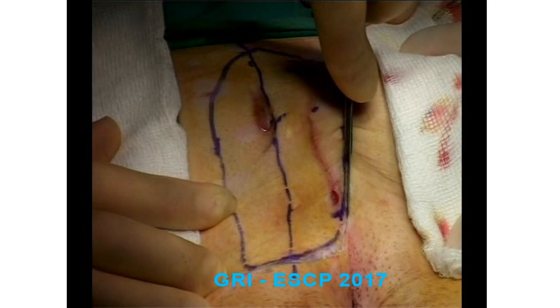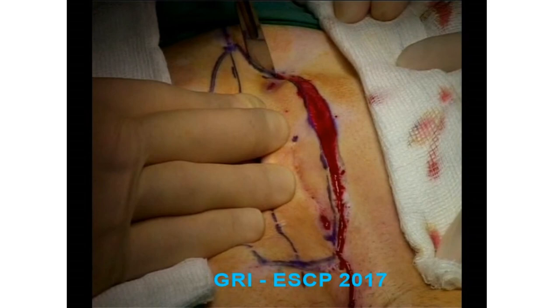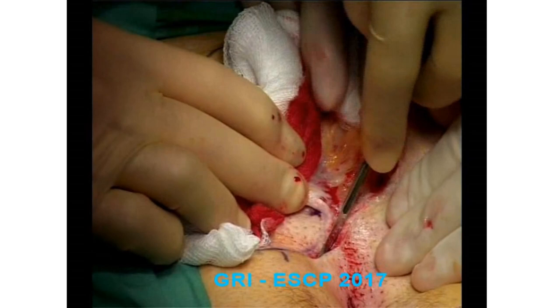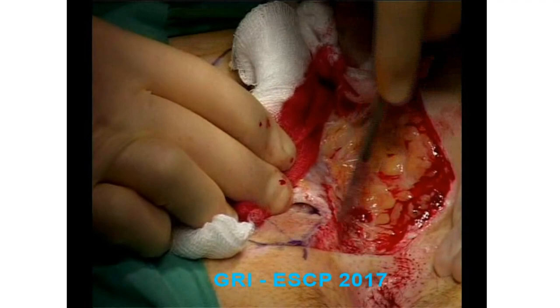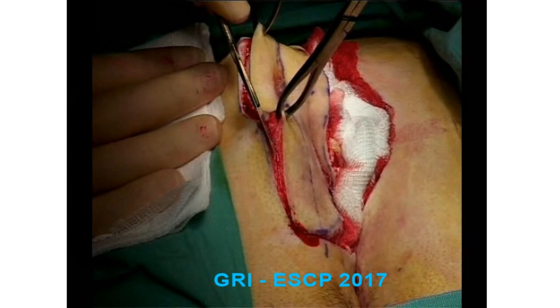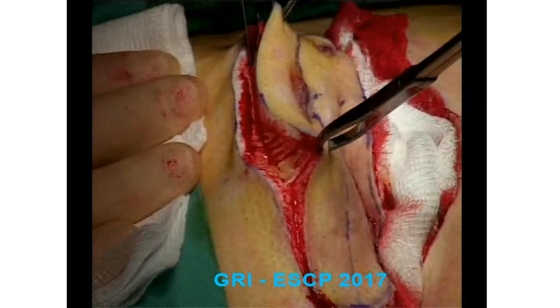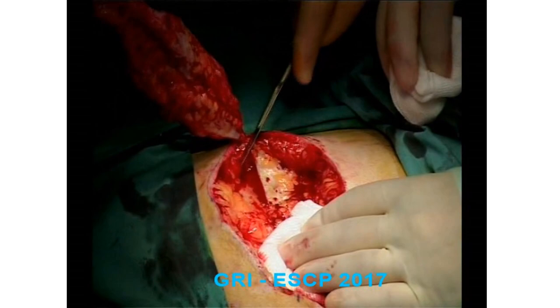The excision has a vertical edge; bleeding is stopped with pressure rather than diathermy. This illustrates the vertical excision on the medial aspect. Littlewood's forceps are used to elevate the tissue to be excised, and the incision is angled at 45 degrees on the lateral side, leaving as much fat as possible behind and excising just deep to the sinus.